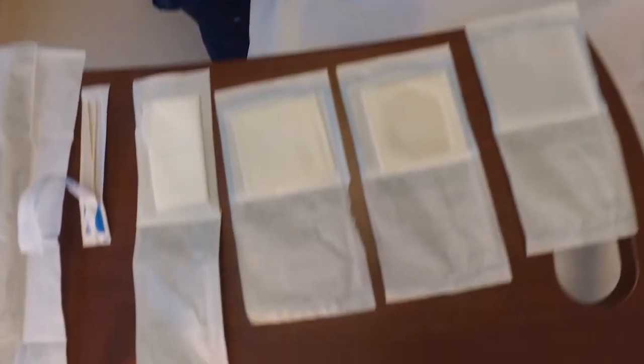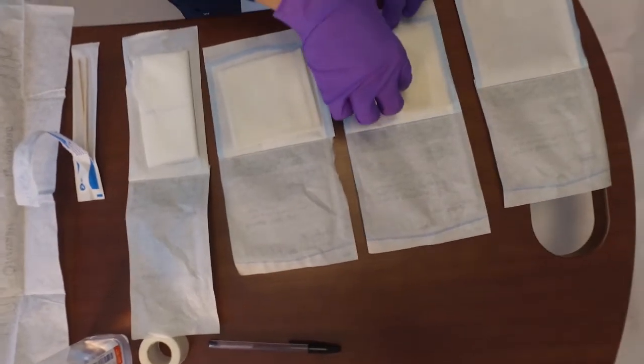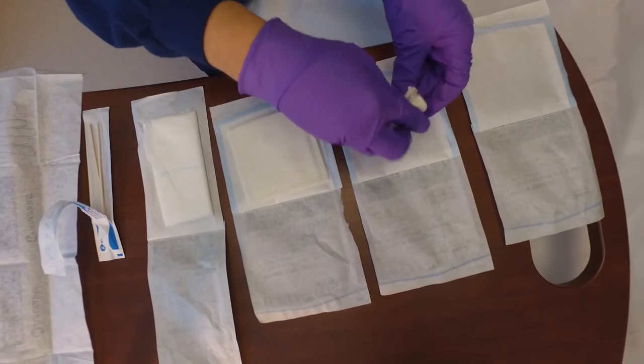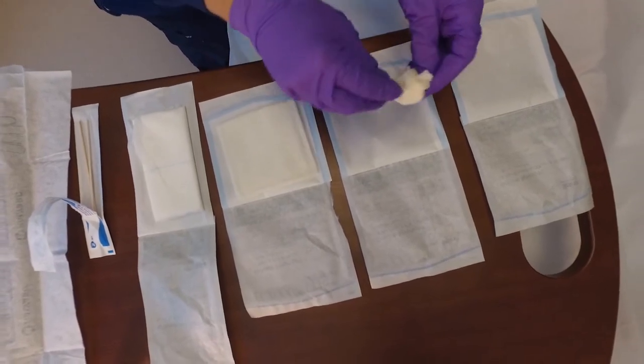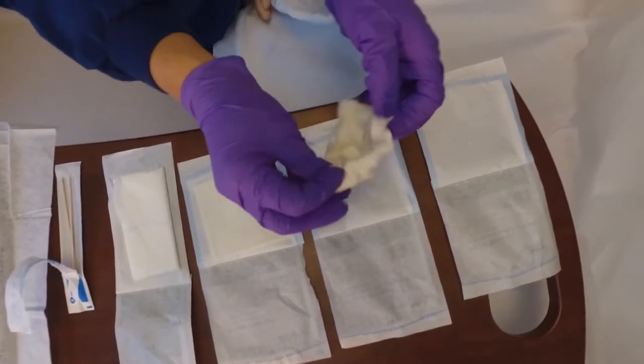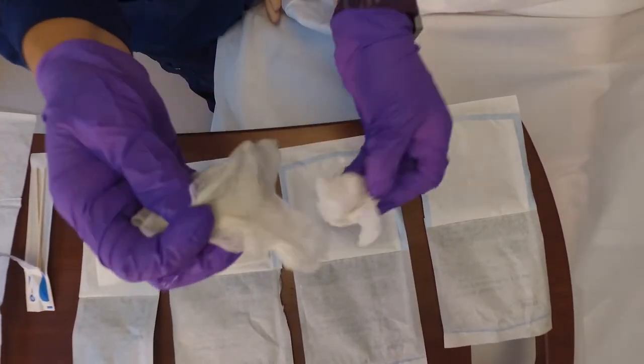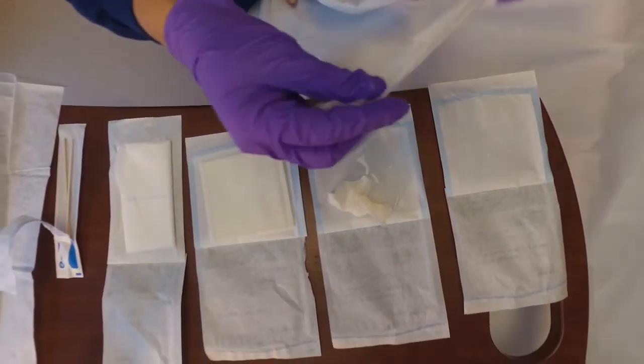Next, the nurse will squeeze excess fluid from the moistened gauze. She will then unfold and fluff the gauze to create a thin layer that will contact all wound surfaces.